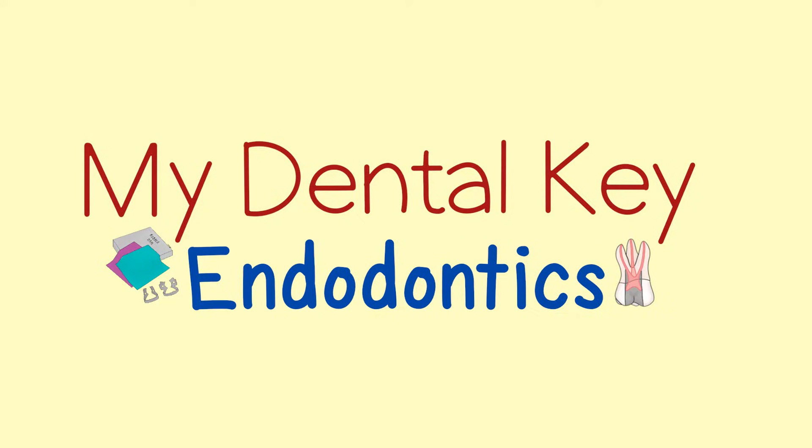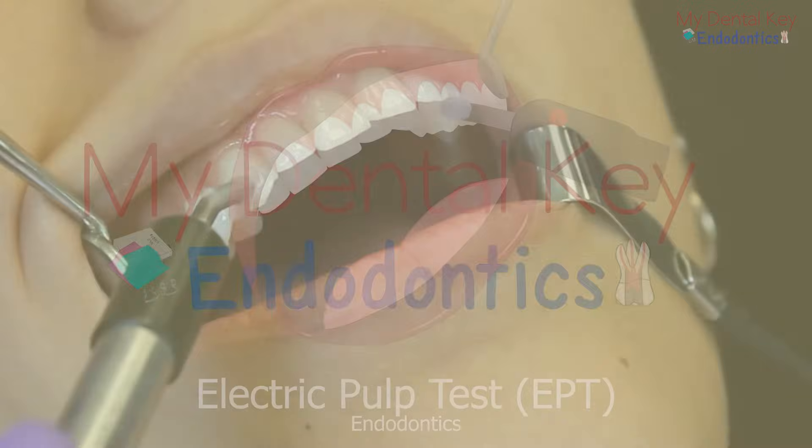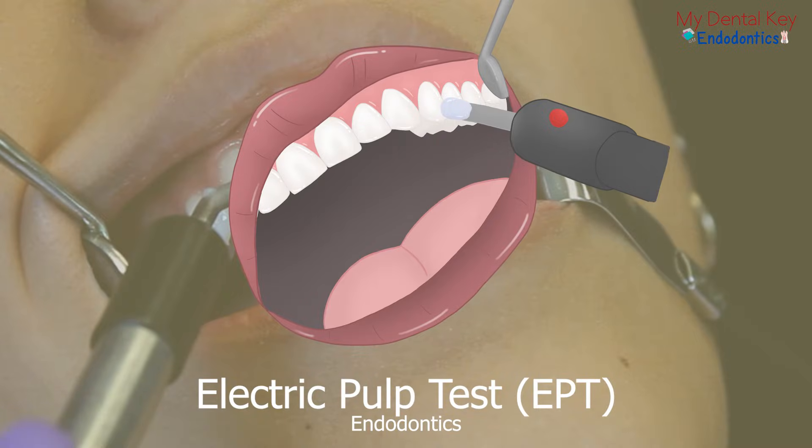This video will cover the electric pulp test. Following an extraoral and intraoral exam, the electric pulp test may be performed as part of a thorough round of testing on selected teeth. Our other modules cover percussion, probing, palpation, mobility, the bite test, and the cold test, all of which are useful in reaching an endodontic diagnosis.